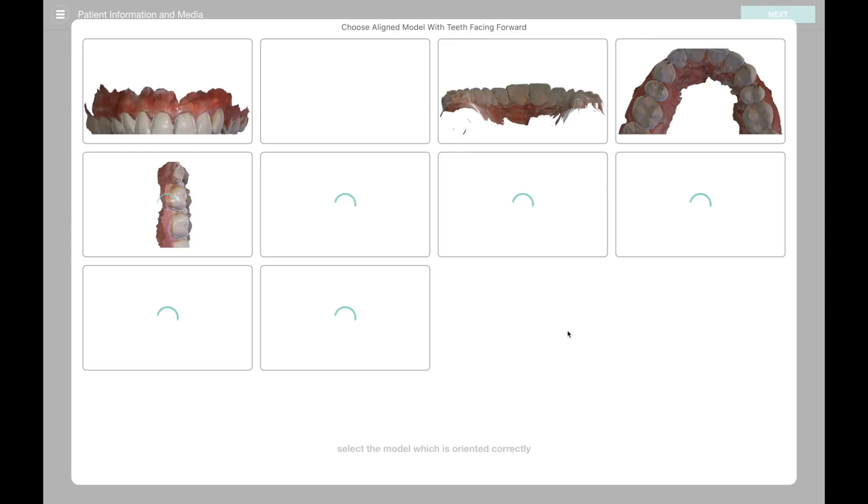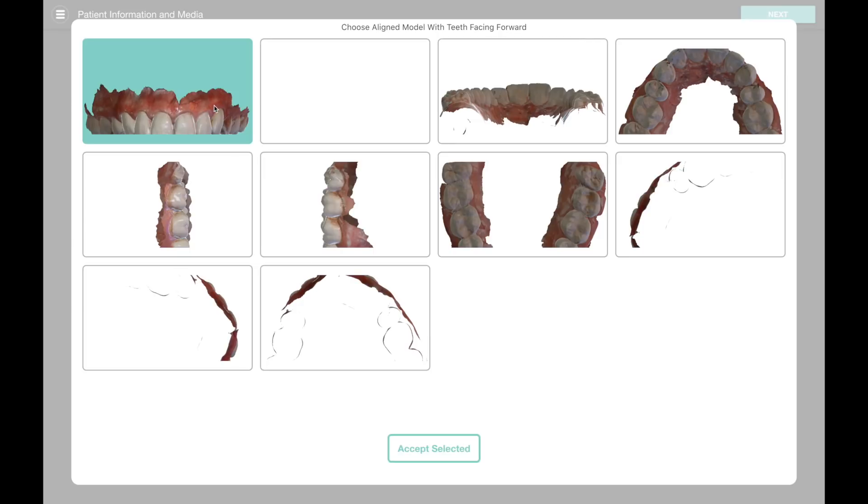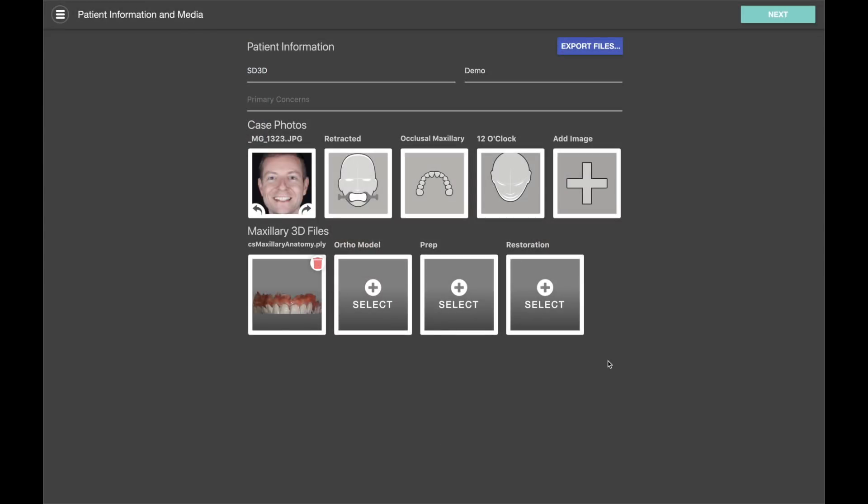So when we bring in our PLY file, the software renders the model from different views, so we just have to pick the one that has the model oriented correctly with the teeth facing forward. Once we've imported our model, we're ready to go to the next step.